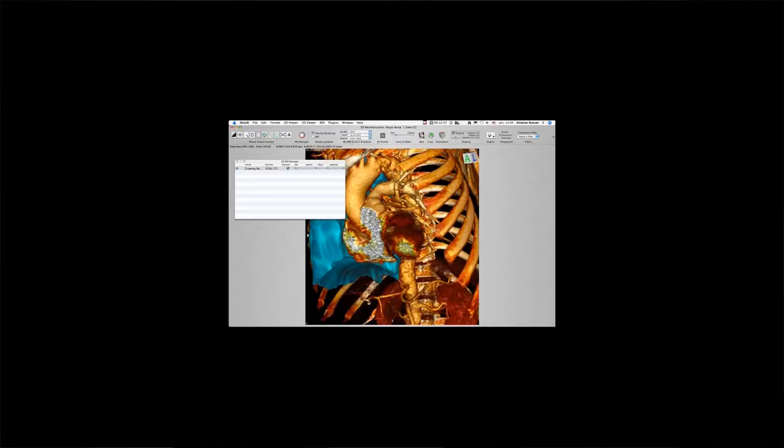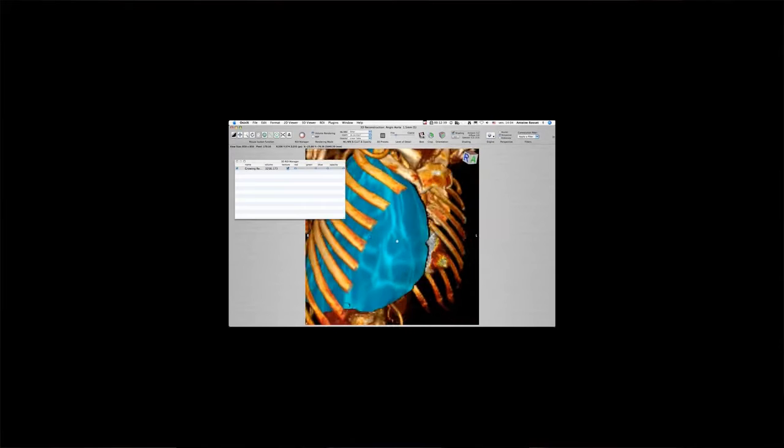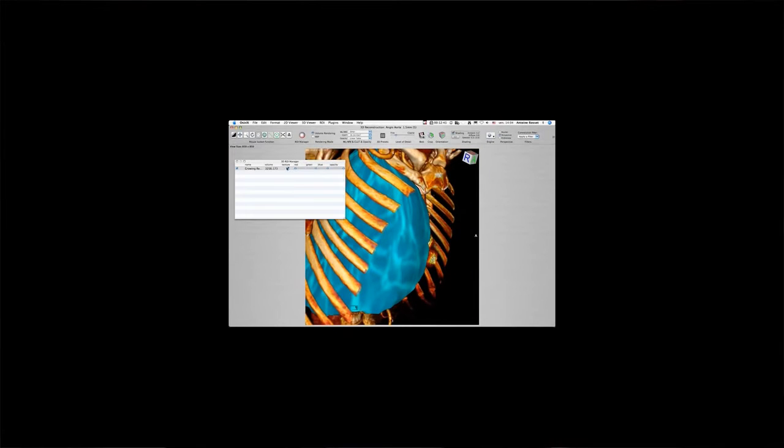Imaging in general, you could think of a straight X-ray, dental X-ray or whatever, ultrasound, right? They're all different kinds of images. Volumetric is where you say, we really want the full 3D volume.